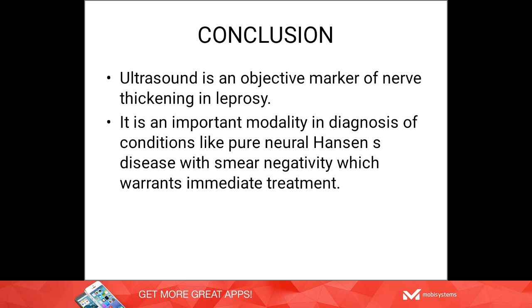To conclude, ultrasound is an objective marker of nerve thickening in leprosy, and it is an important modality in diagnosis of conditions, especially pure neural Hansen's with smear negativity, which warrants immediate treatment.